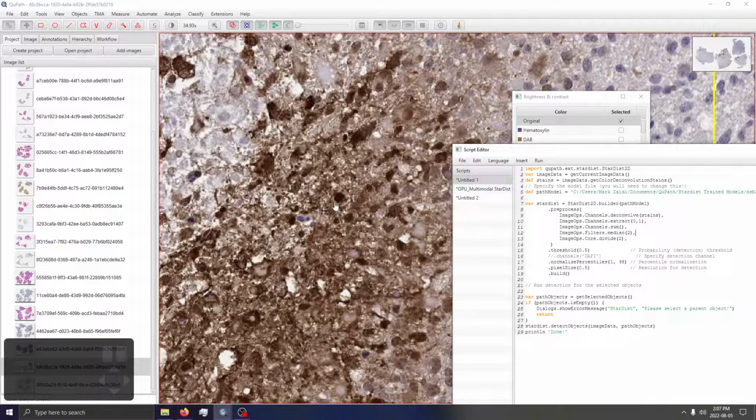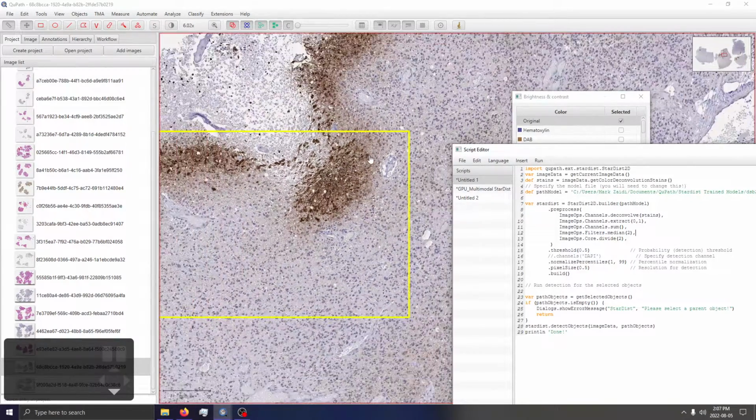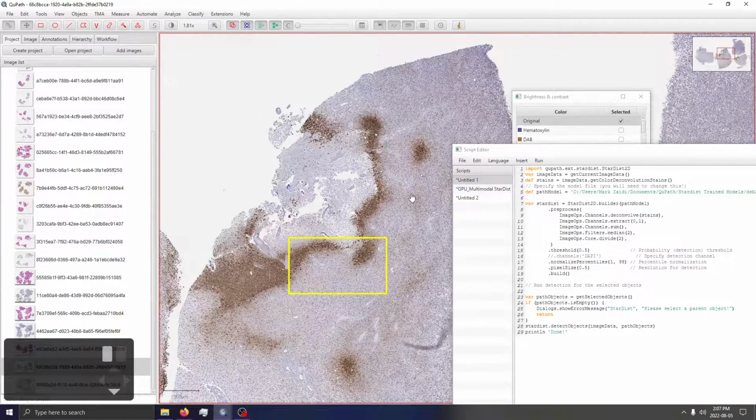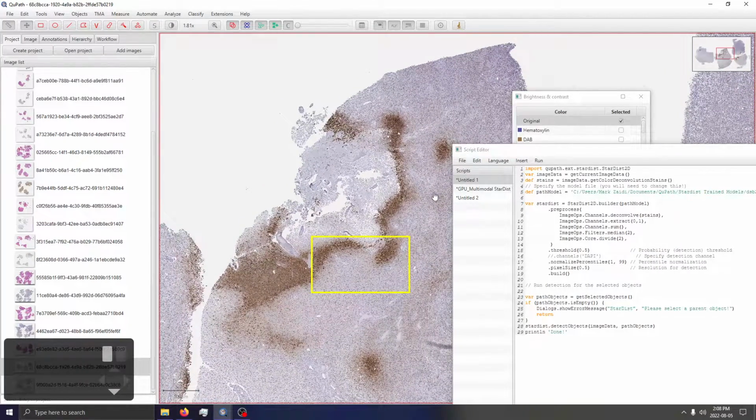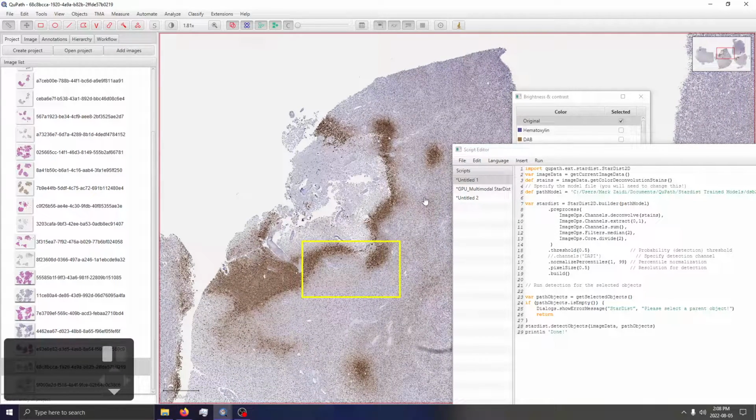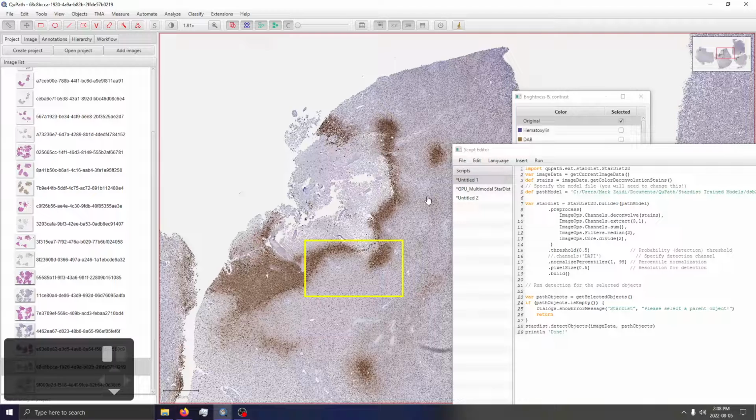Now, one of the reasons I don't recommend using DAB staining is because the results of any analysis are going to be dependent on the quality of your deconvolution, as well as the parameters used, types of models used for deconvolution, and a wide variety of other confounding factors, which can hinder reproducibility in a new data set. In immunofluorescent microscopy, at least you don't have to deal with deconvolution, but there are some limiting factors with any imaging modality.